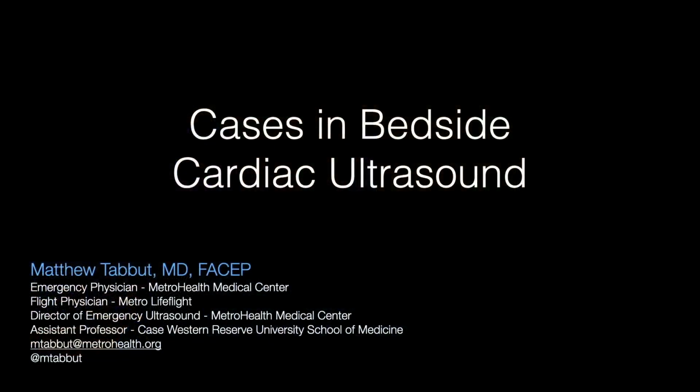Without further delay, we're going to dive right in and talk about cases in bedside cardiac ultrasound. This is a presentation I put together a couple of years ago with some cases that we've seen here. For the purposes of confidentiality, I want to make a disclosure at the front end.